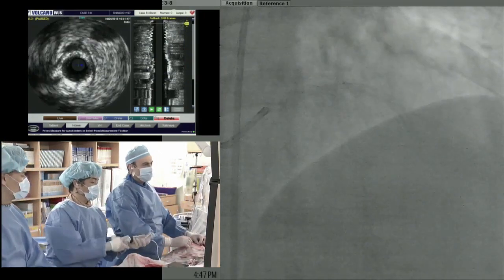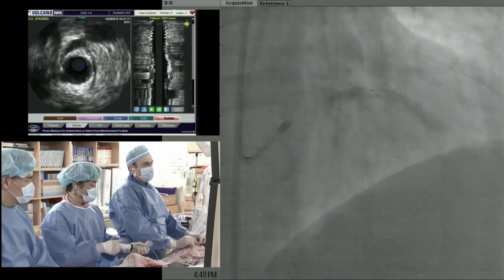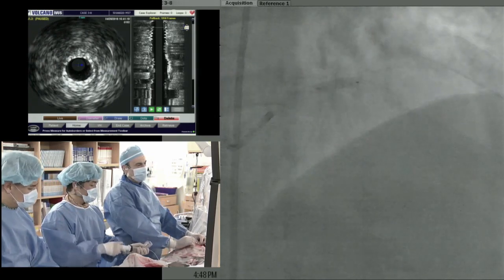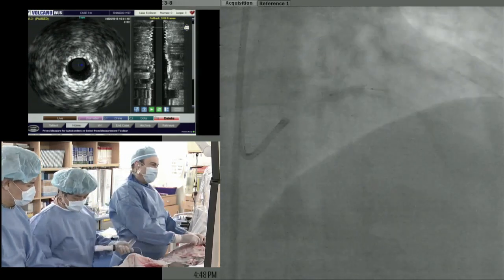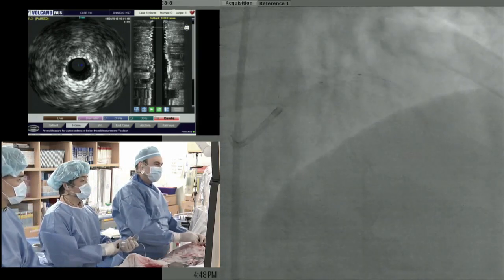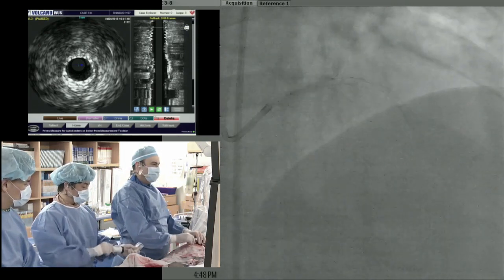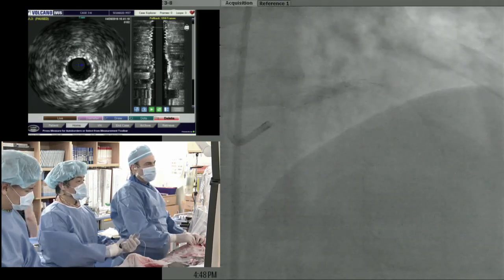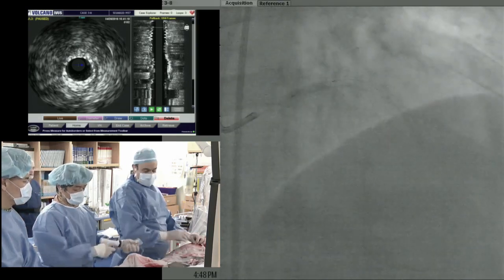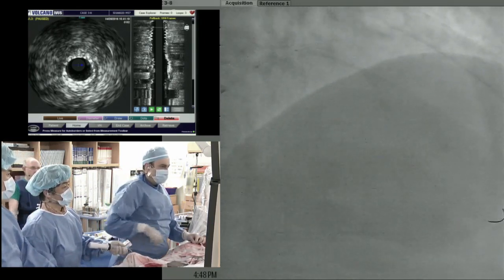Okay, let's go up there. Right now? Yeah. Let's go 18. 12, 18, 20. 18, 20. Down. 20. Actually, this kind of left main in clinical practice, we are not doing the kissing balloon. Just leave it.